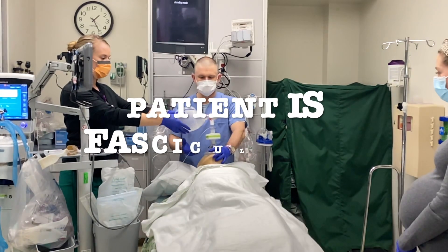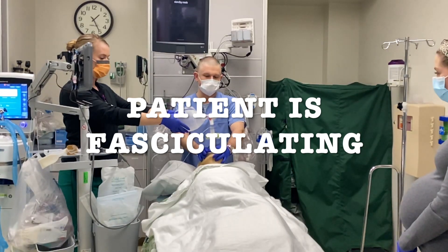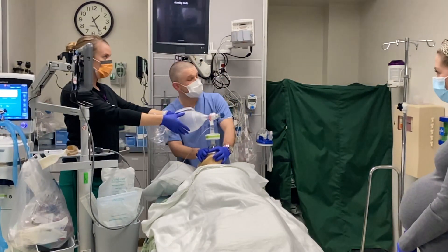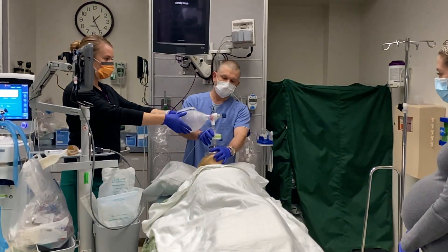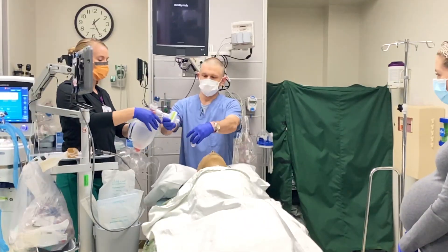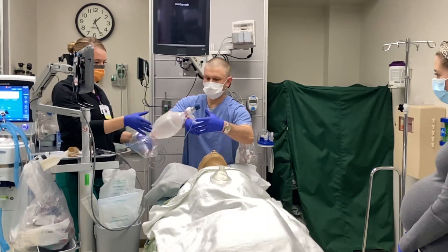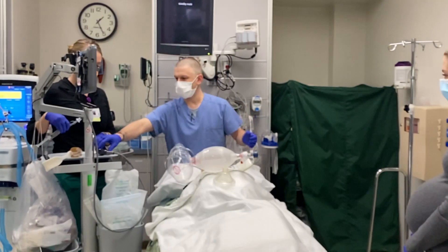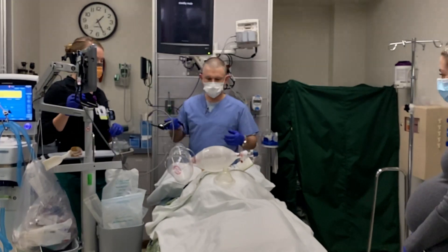I can see that the fasciculation has occurred. There's no more spontaneous breathing and our saturations are fine. So what I'm going to do is remove this, put it to the side, and we're going to get ready to intubate the patient.